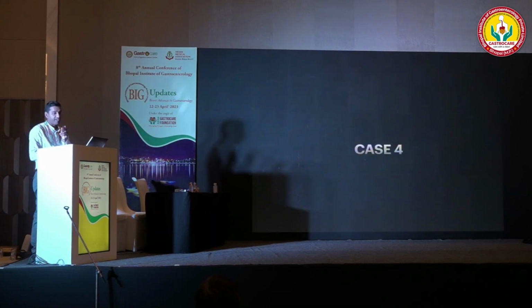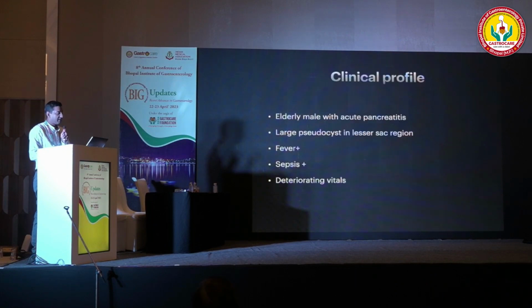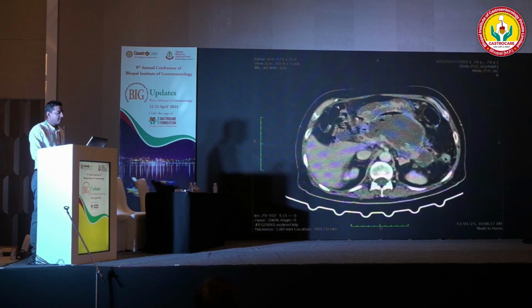Now coming to the final case, this is the most interesting case which we did recently. Basically, it's an elderly male with acute pancreatitis. He had a large pseudocyst in the lesser sac region, fever with sepsis was present, and he had deteriorating vitals. CECT was done. CECT showed pancreatitis with a large collection in the lesser sac region. This is the stomach. The stomach is pushed anteriorly. There is a collection behind the stomach in the lesser sac region.